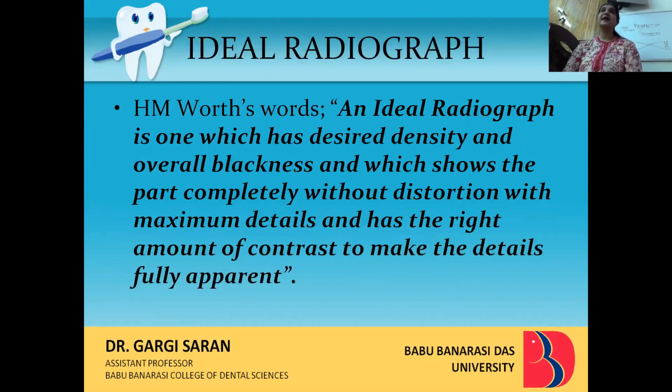So what is an ideal radiograph? According to H.M. Worth, an ideal radiograph is one which has the desired density and overall blackness, and which shows the part completely without any distortion, with maximum detail, and has the right amount of contrast to make the details fully apparent.